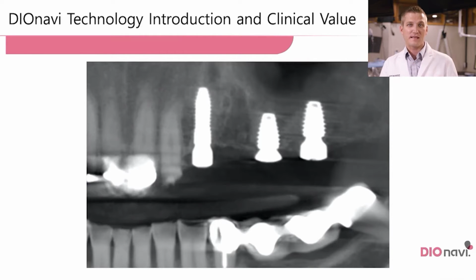I love a system that lets me, as the clinician, feel like I'm doing a great job for my patient, saving time, saving stress, and getting 3 implants just like that, parallel, thoughtfully planned relative to our prosthetics in a way that is efficient, a good use of time. Everyone is winning. My patients appreciate it, my clinic appreciates it, I certainly appreciate it as the clinician. I think that tells a big story right there.